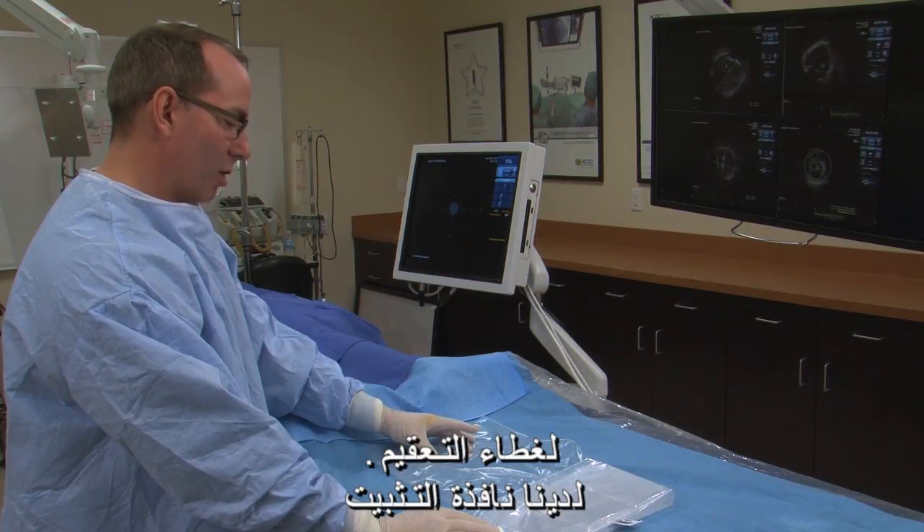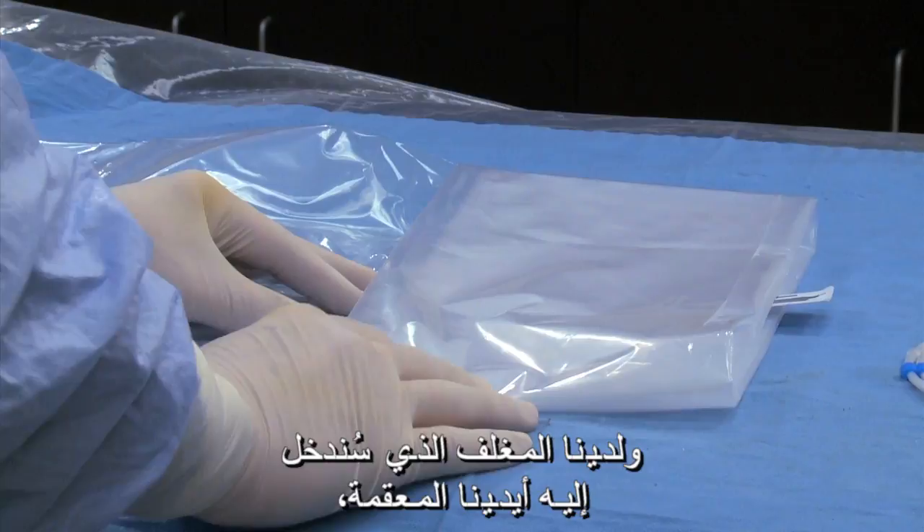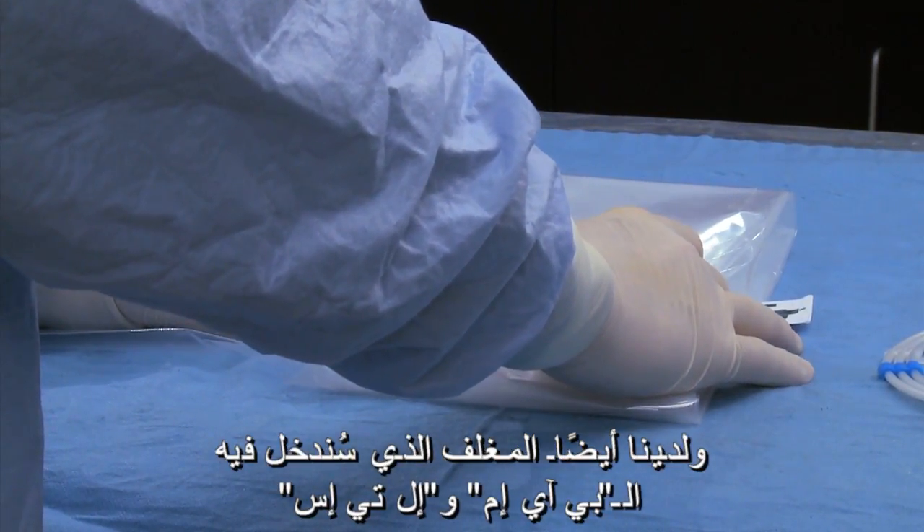We have the anchor window, we have the tab where we are going to insert our sterile hands, and we also have the tab where we are going to insert the PIM and LTS.